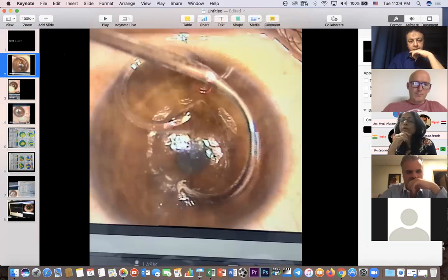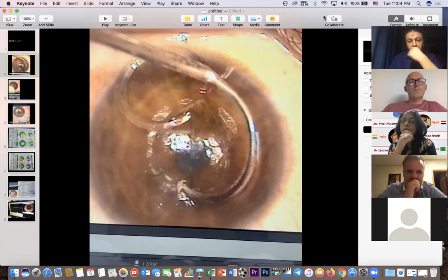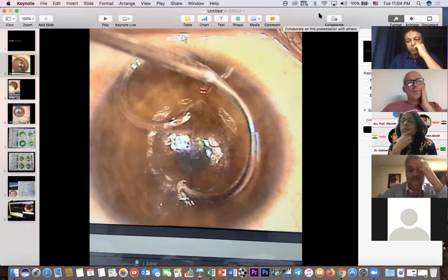If you remember in my presentation, I showed you an example of a girl who had undergone CAIRS with cross-linking simultaneously in one eye, and then 1 year later she came back. We had cross-linked her other eye also, but not put in CAIRS because she did not have the money to go for CAIRS in both eyes. And 1 year later, she came back to do a CAIRS because she found no difference in the left eye and a lot of improvement in the right eye. And we could not get her the same result that she got in the right eye. In the right eye, she improved to 6/6 uncorrected. In the left eye, I don't remember now, I think she was 6/12. She was still very happy because that was significant improvement for her.